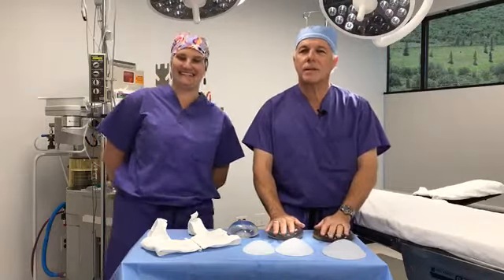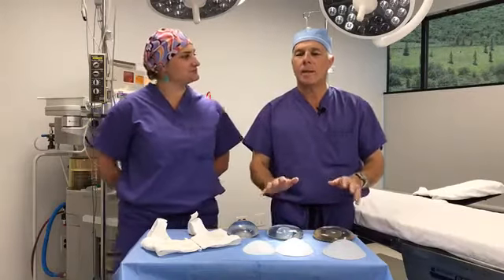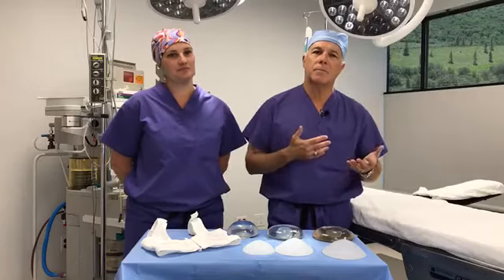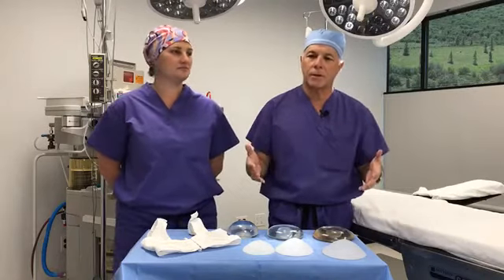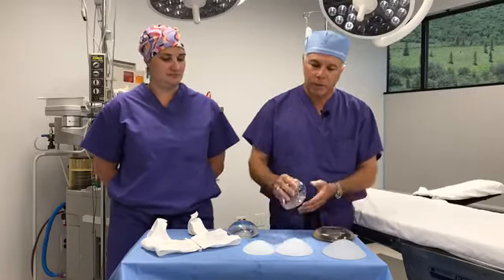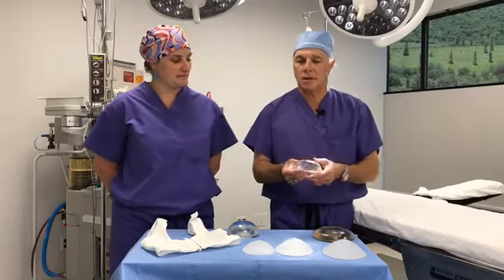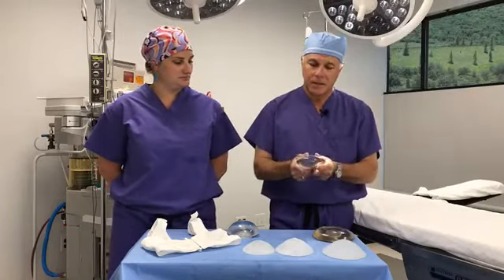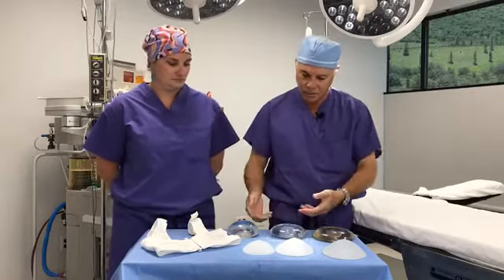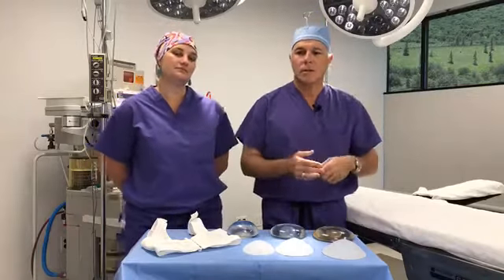Okay. The last thing we talk about, silicone and saline. The bottom line is all implants have a similar complication profile, which is putting something foreign in the body. It's not really critical what's inside the implant, what we call the implant shell. Obviously, silicone, the reason we use it is because the stuff inside is thicker. Some people say it's like a gummy bear. If I sliced it, it would just sit here, it wouldn't run off the table. Saline is obviously the salt water that goes into your IV.